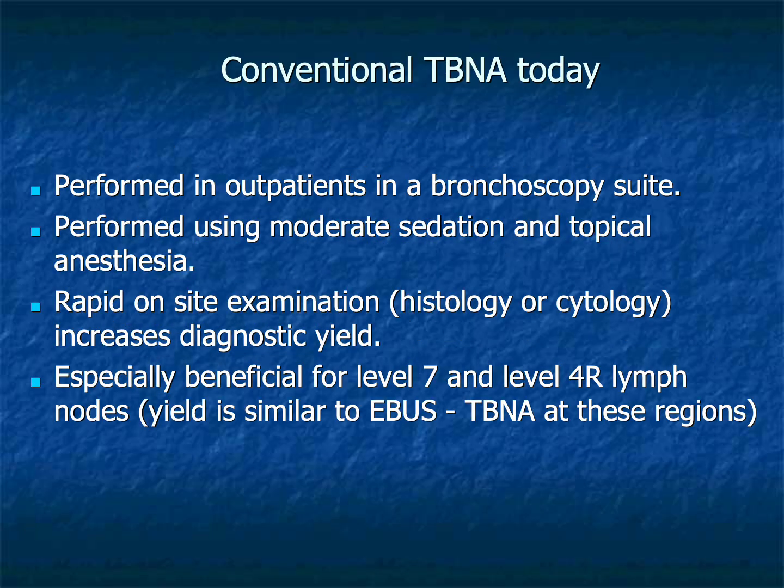Modern conventional TBNA is usually performed as an outpatient procedure under moderate sedation and topical anesthesia. One of the major advances has been the use of rapid on-site cytologic evaluation, commonly known as ROSE. Immediate microscopic examination of aspirated material allows confirmation that representative tissues have been obtained, reducing unnecessary needle passes while improving diagnostic yield.